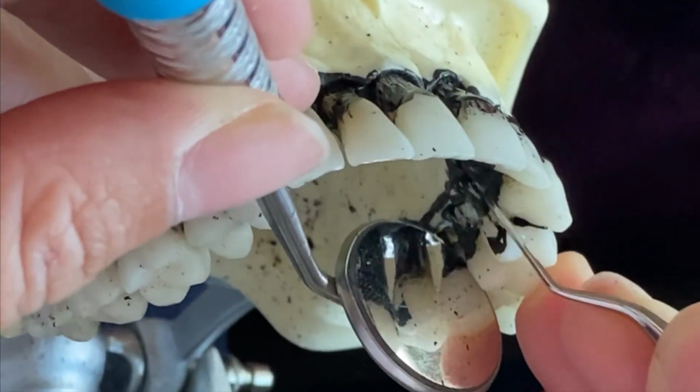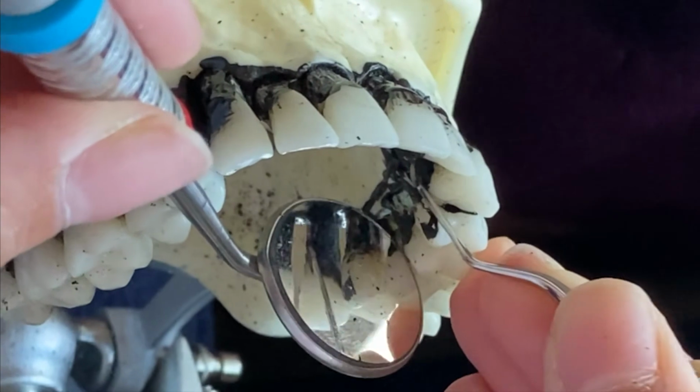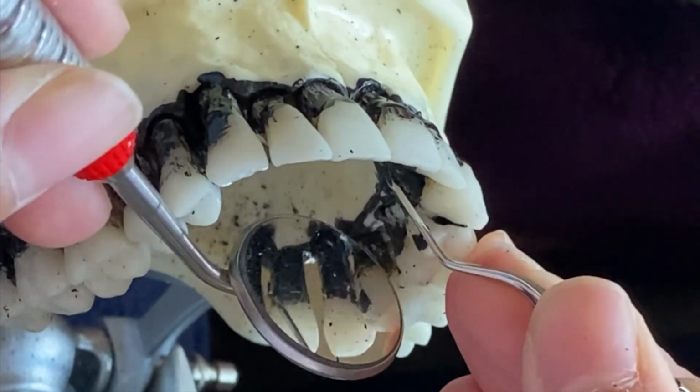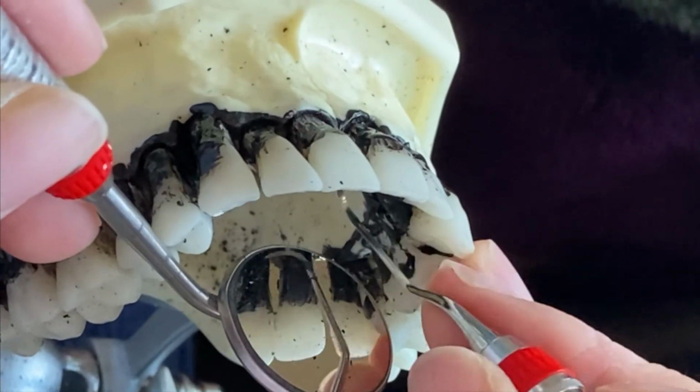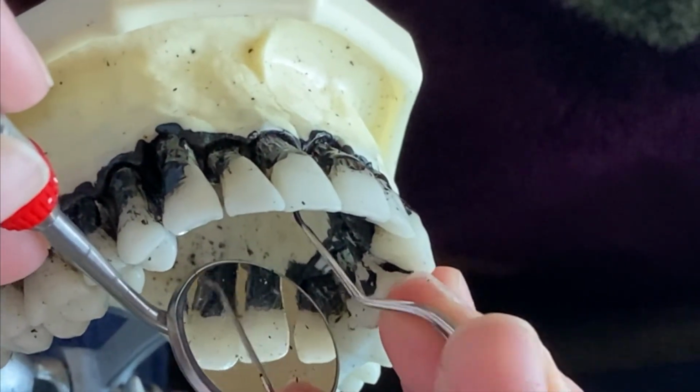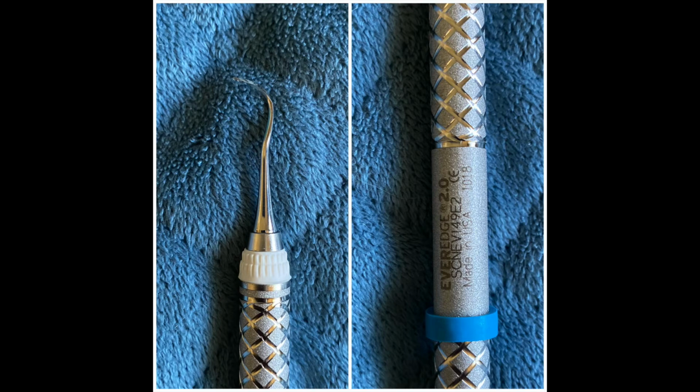Now we'll start with the maxillary anteriors, again doing surfaces towards and surfaces away, with the same technique and chair positions as used when exploring. Another instrument that can be used for the anterior interproximal areas is the Nevi 4, and I'll be demonstrating this instrument on the mandibular anteriors.